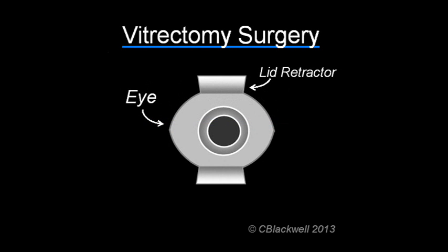Here is the setup. This is the surgeon's view looking down through the operating microscope at the eye with lid retractors already in place.